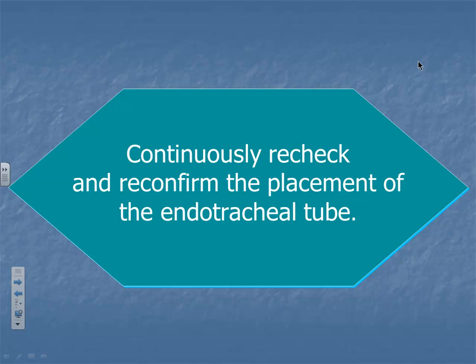So what do you think the D stands for? Displacement. Yeah, who said that? Was it in your book? You're just smart, huh? Yeah, you want to check to see if your tube has been displaced. Has it come out and it's in the gut? How can you check that? Well, if they're just laying there and you're just listening, you got to put breath in there and auscultate over the epigastrium while you're giving them a breath.